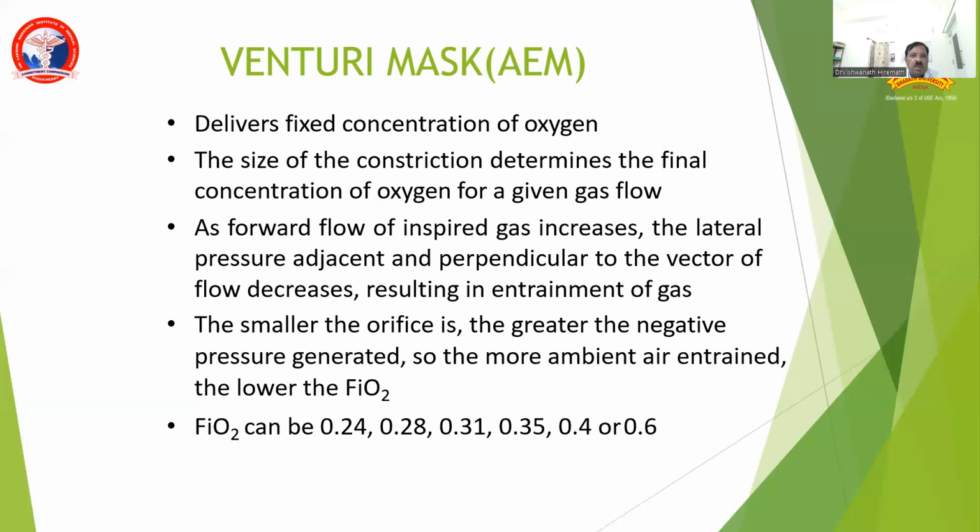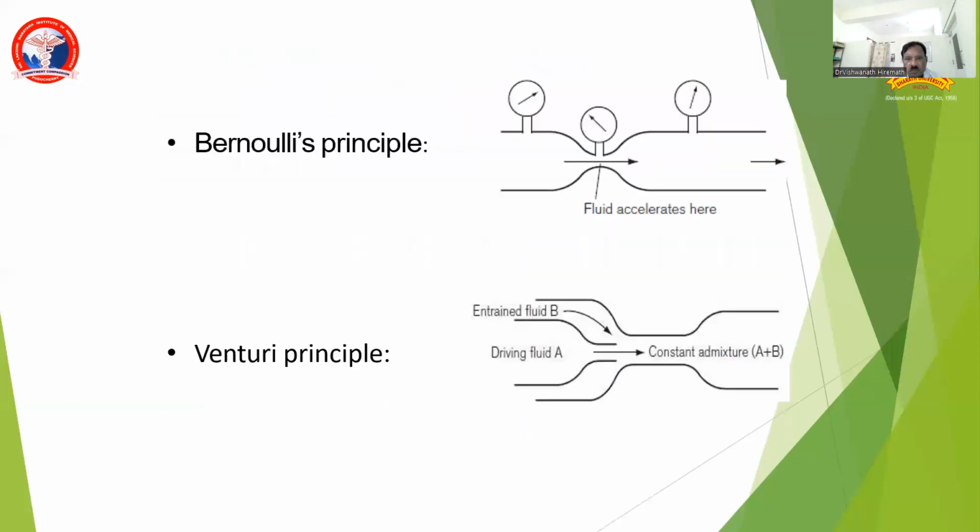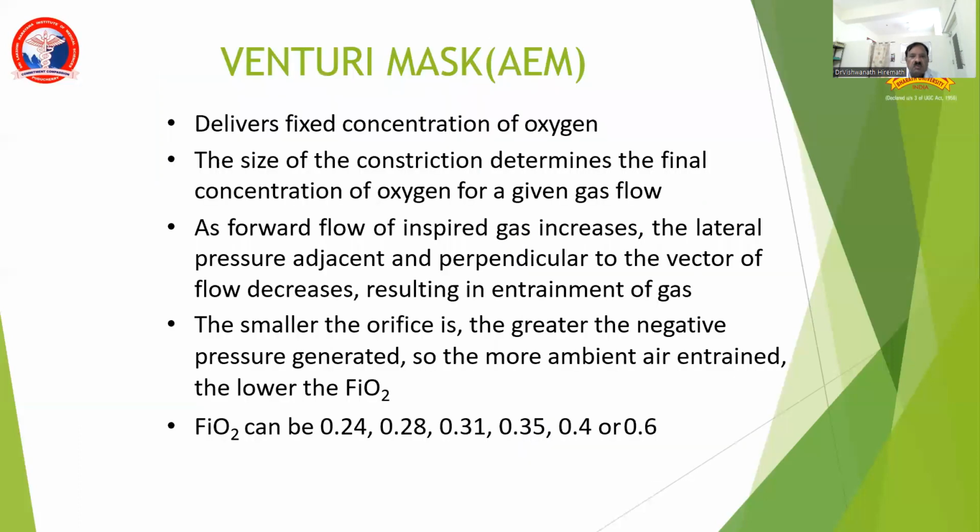Air entrainment delivers a fixed concentration of oxygen. The size of the constriction determines the final concentration of oxygen for a given gas flow.